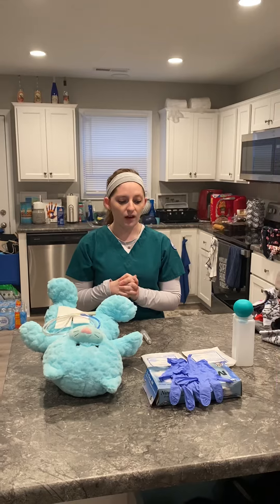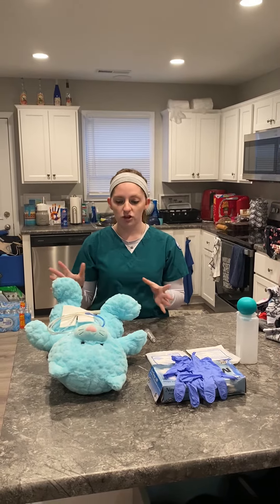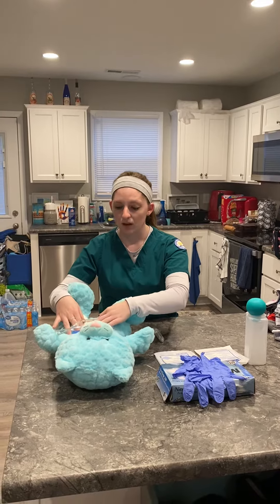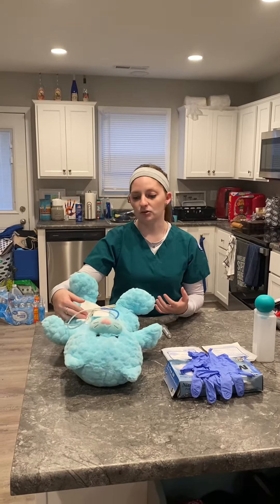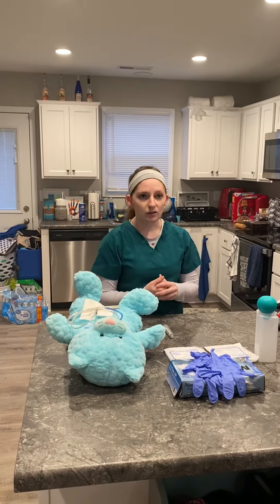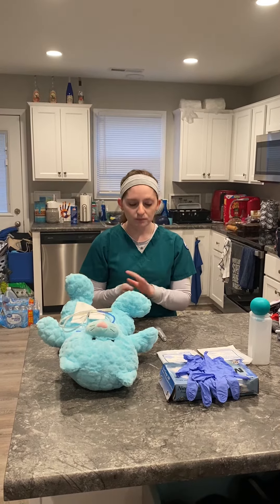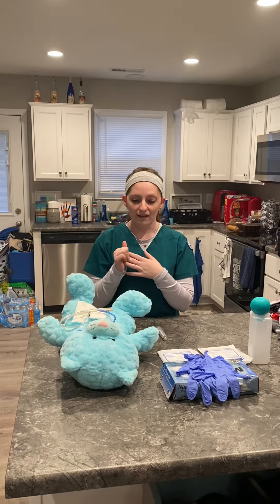To start off, I'm going to check that my patient needs a replacement tube. I verified that they need the replacement tube, so I obtained an order from my physician with the type of tube and the size of the tube. Once I have that, I'll proceed.